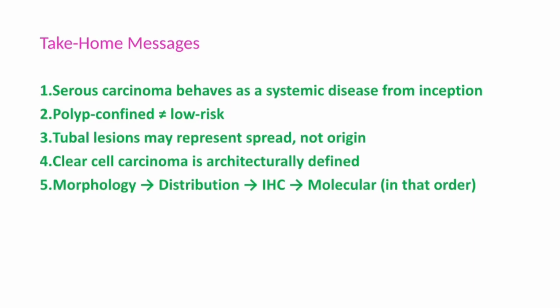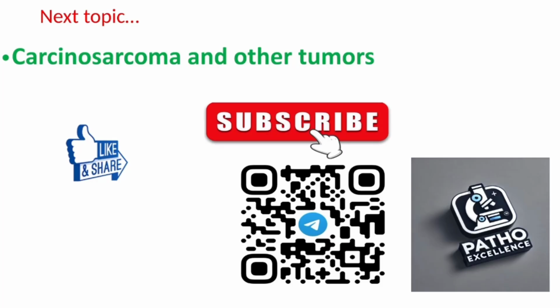So, morphology come first, IHC supports the diagnosis, and staging must always be meticulous. So, I hope now you can easily identify serous and clear cell carcinoma under microscope.